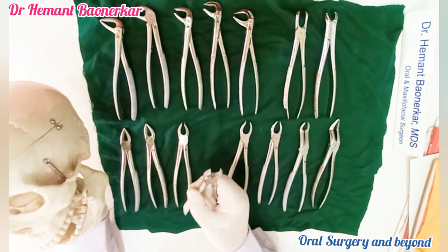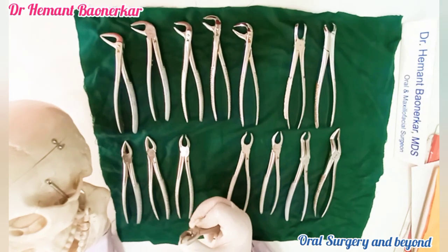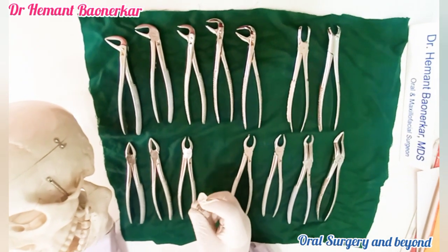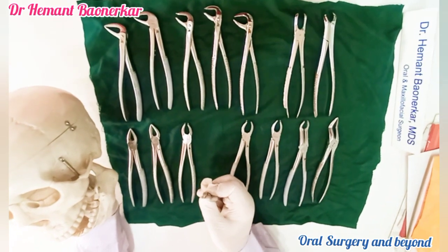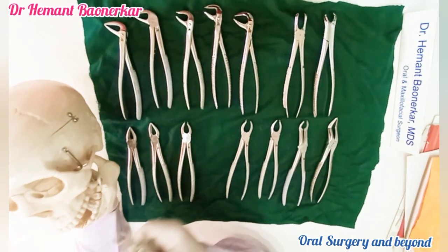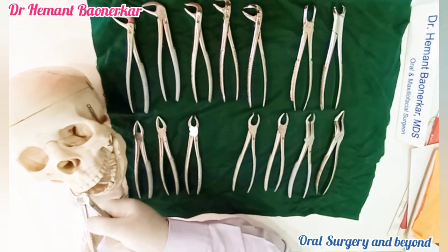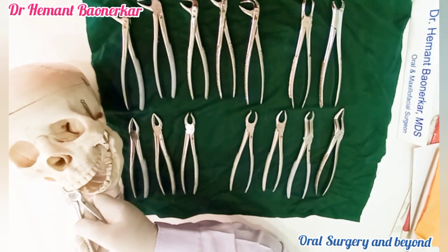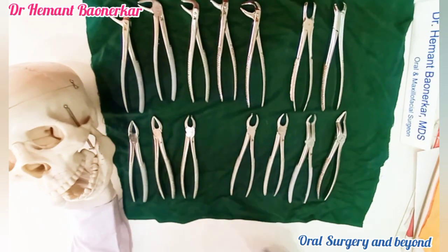This maxillary molar forceps is for the first quadrant. How can I identify? Because this small tip is on the left side. We can hold it like this, give rotation and buccal movements, and we can extract the tooth. I am showing all these small demos on my demo mandible, so exact extraction is not possible.